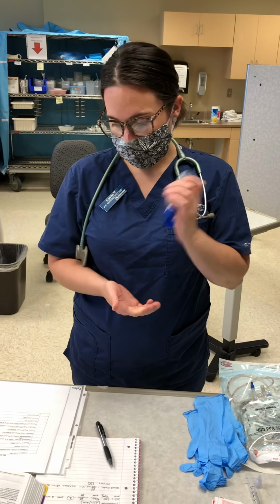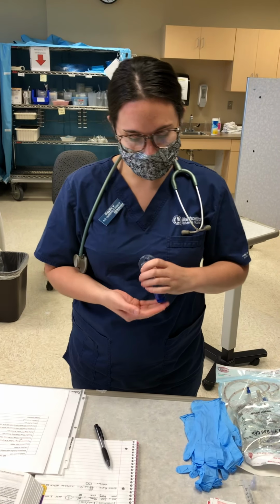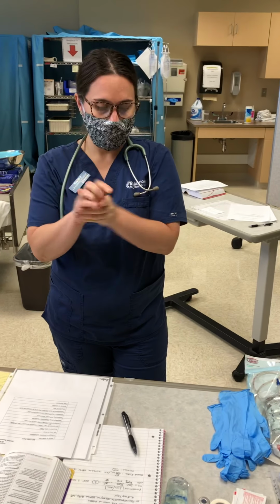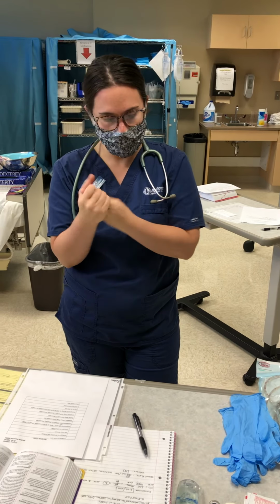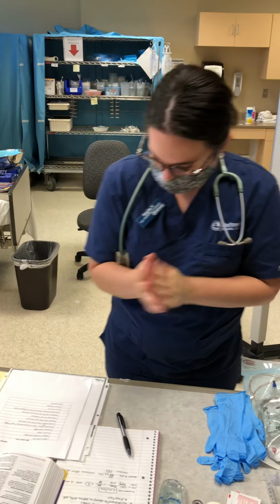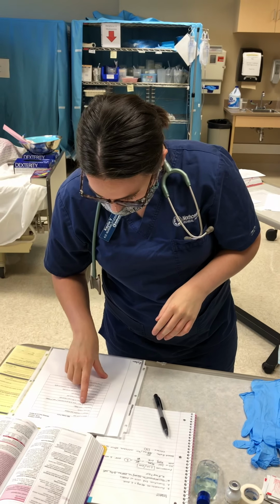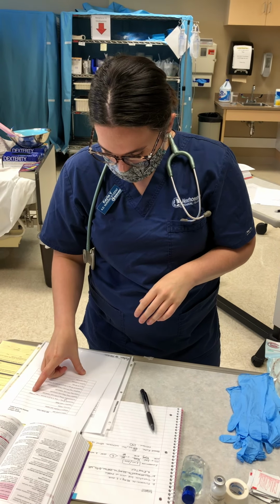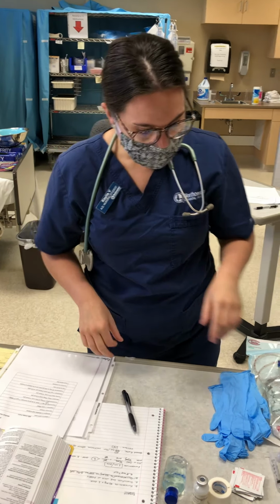Alright, I just checked my orders, and my patient Eugene Williams is to receive a dose of furosemide before his second unit of blood. So I'm going to get that ready. Checking the MAR. Furosemide 40 milligrams times 1 dose to be given between first and second PRBC via IV piggyback.